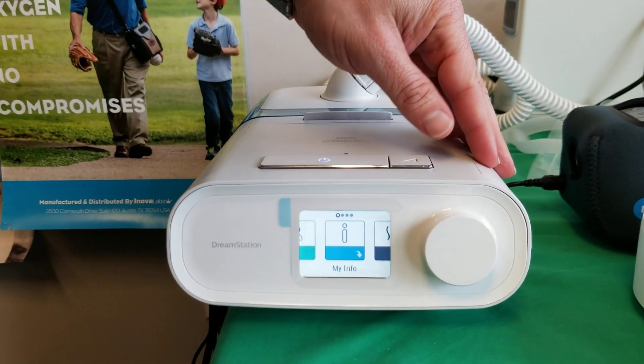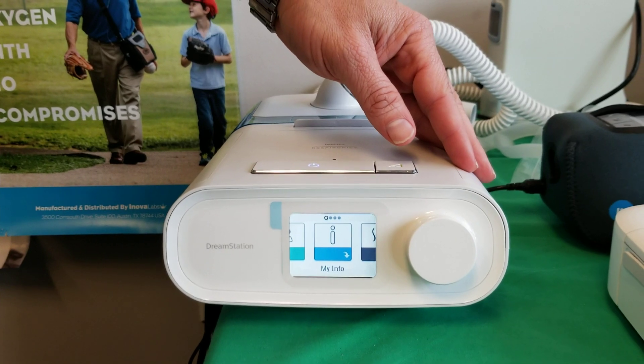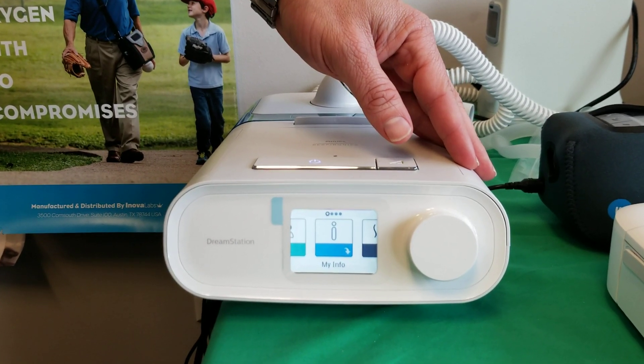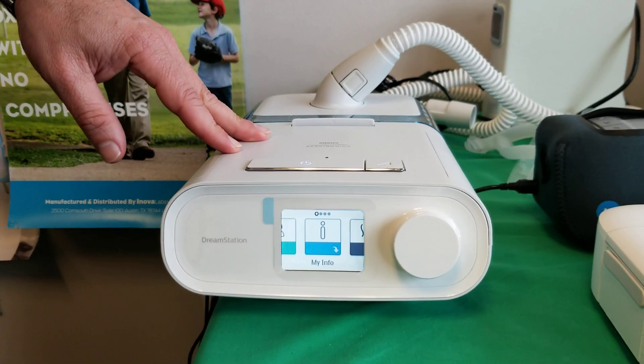It's Mike, Medical Equipment Specialist. We're going to go over the flex setting today on the DreamStation. Flex basically means when you exhale against the pressure, it makes the flow drop a little bit and make it easier to breathe against the machine. Considered a comfort setting in the DreamStation model.